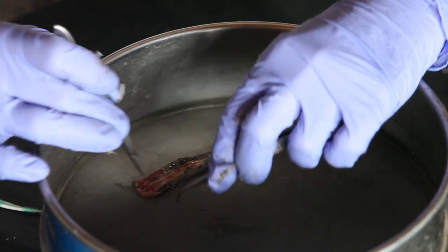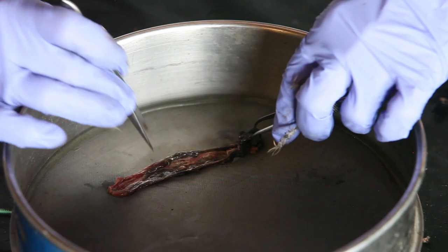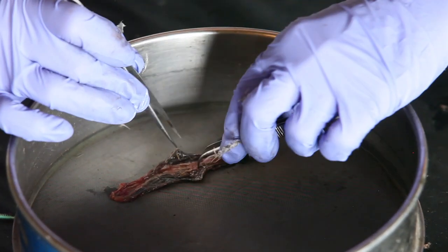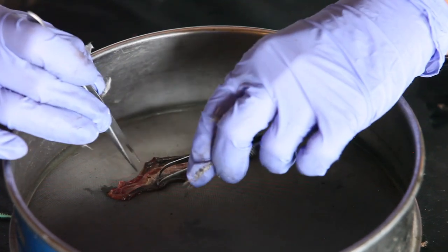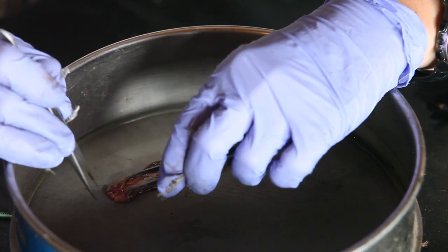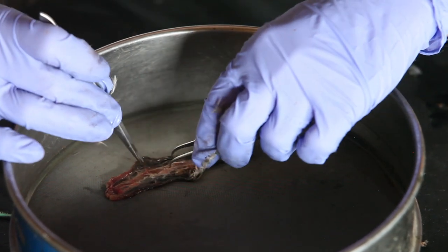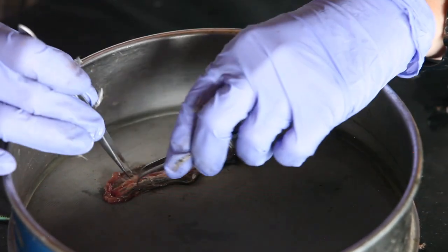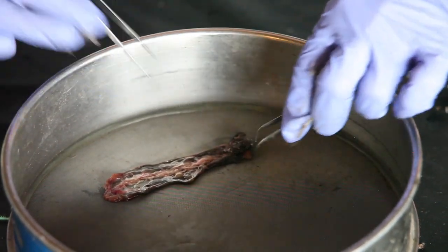Now you said three tracts. I said there were two ceca. So right. What's the third one? The small intestine runs through the middle. Okay. So if we lay this out flat, separate it. And you can see that the cecum, both sides are here, the two green sides, and you've got your small intestine running down the middle.